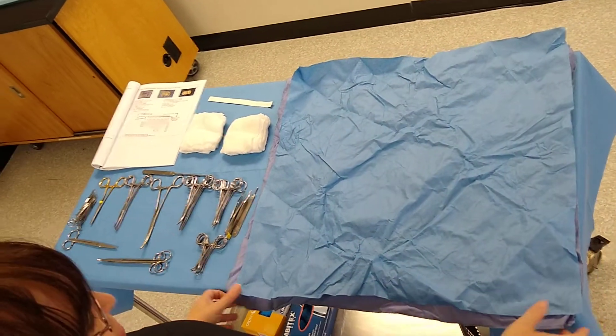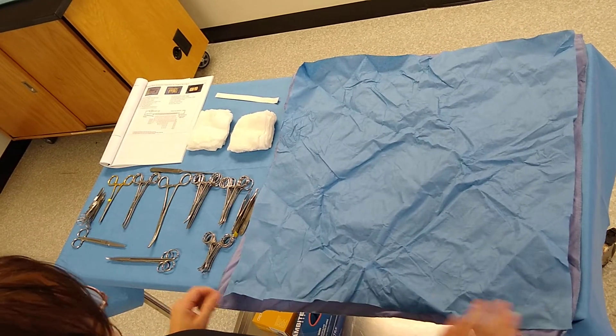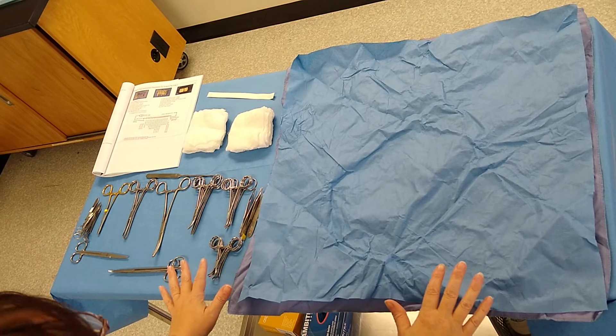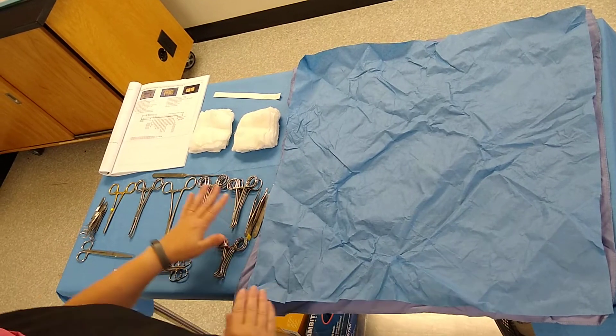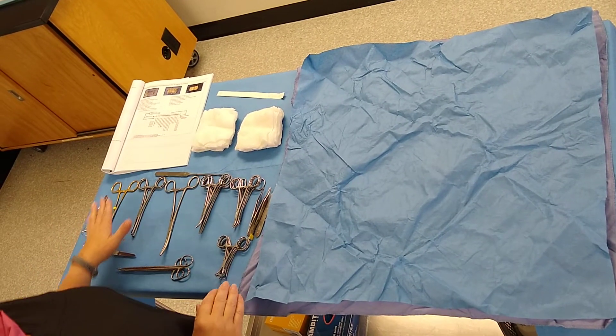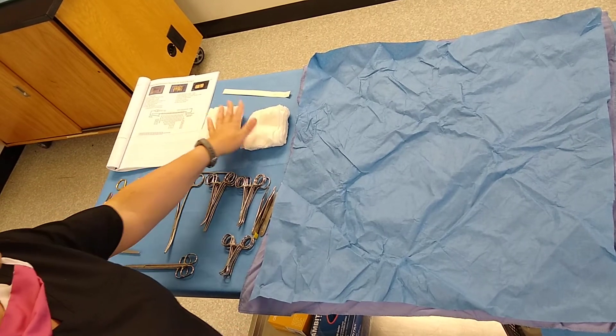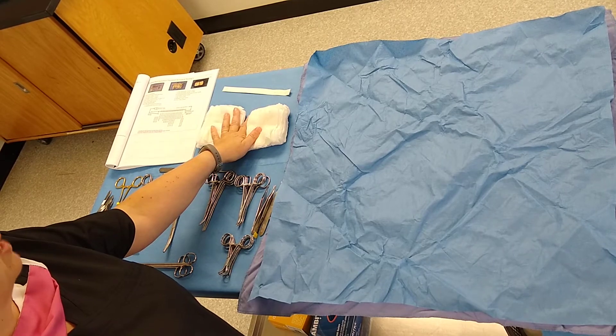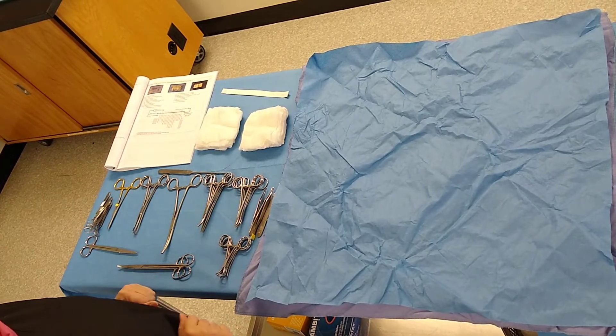We're going to start to wrap our spay pack. The first thing you want to do is lay out all the items you're going to need. I laid out and identified all the instruments and we have a master list for you. I laid out my 20 gauze squares — they're pre-counted so I don't have to stop to count while I'm wrapping — and my indicator strip.